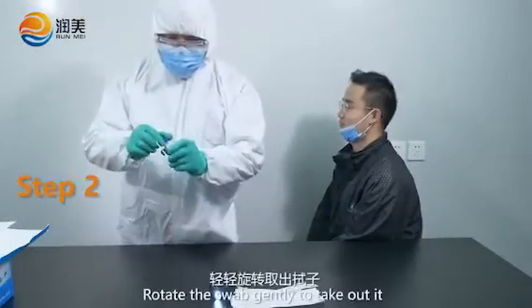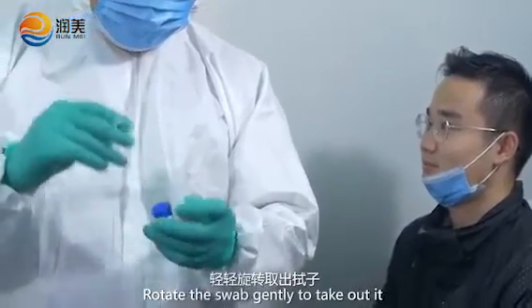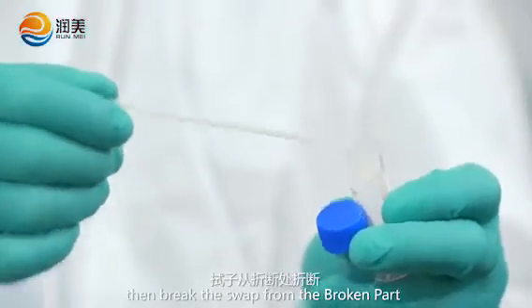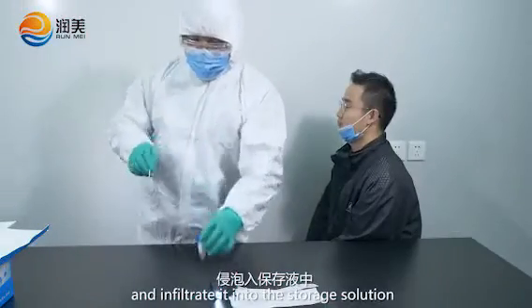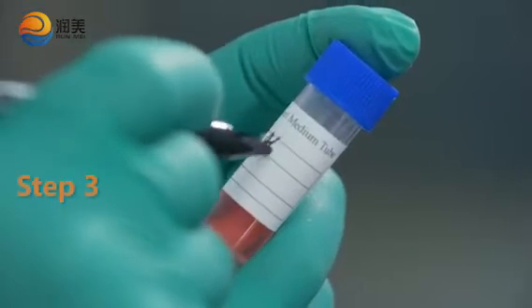Step 2. Rotate the swab gently to take it out and put it into the storage tube. Then break the swab at the broken part and infiltrate it into the storage solution. Tighten the tube cap.